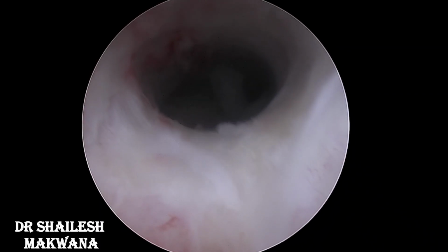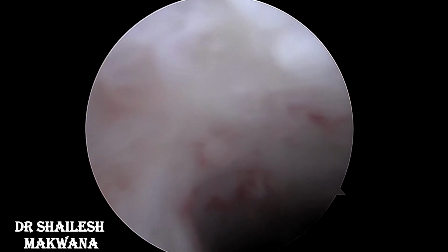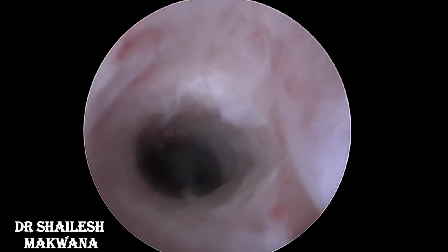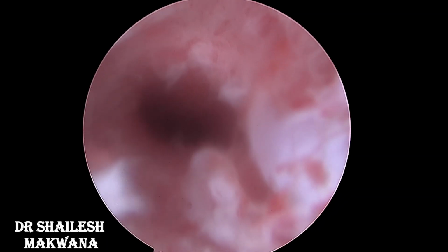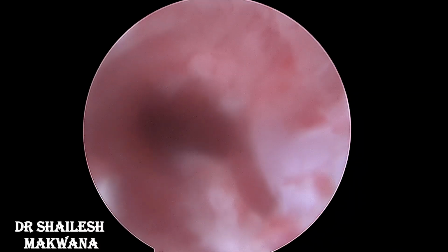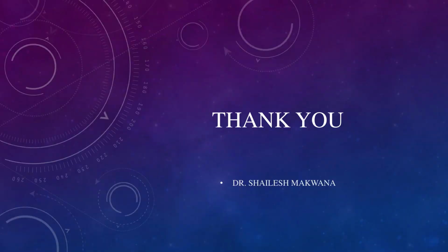Now the cervical canal seemed normal, so we just moved back to the site of the fibrosis to see if there is any residual fibrosis which needed resection with the scissor. Now most of the fibrosis was lysed, so we just moved on with the dilatation of the cervix. And that was it. Hopefully the patient should get her menses soon.